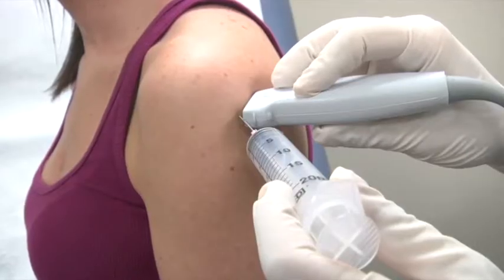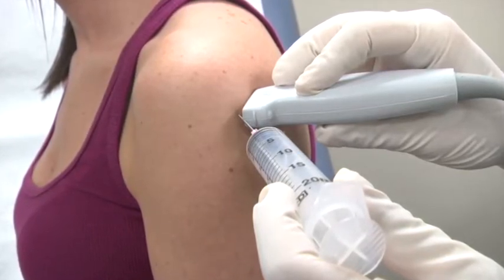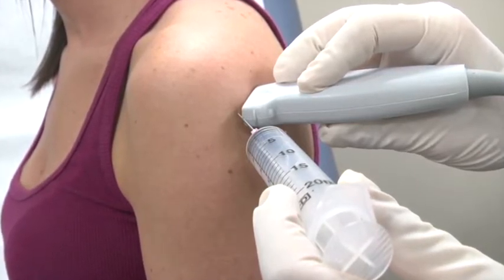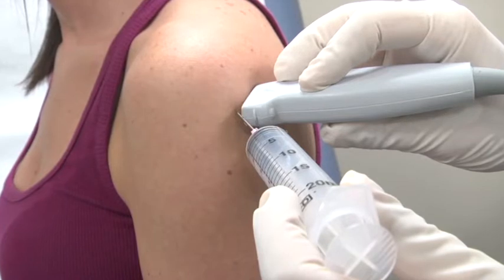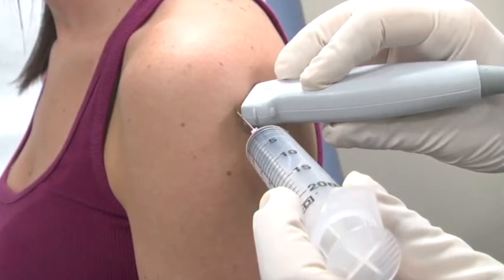Arthrocentesis, or joint aspiration, is an important diagnostic and therapeutic procedure for the emergency department. It may help differentiate the etiology of a joint effusion and may provide symptomatic relief or assist therapy by removing offending material from the joint space.